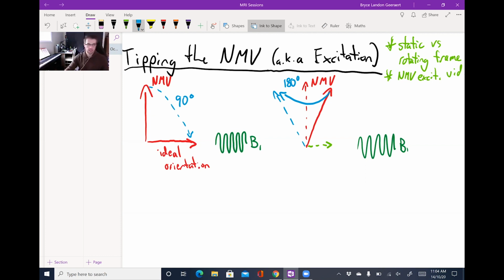So I'm going to try this with my arm. We'll see if it helps at all. So we have our net magnetization vector. It's vertical. It gets pulled this way a little bit, and then it is rotating very fast. So it gets all the way back over here to the 180-degree orientation state. And that same force is just going to pull it back vertical, which means that essentially the tipping force that we want is getting canceled out immediately, unless we use resonance. That's the R in MRI, magnetic resonance imaging. Now the concept of resonance is very fascinating.